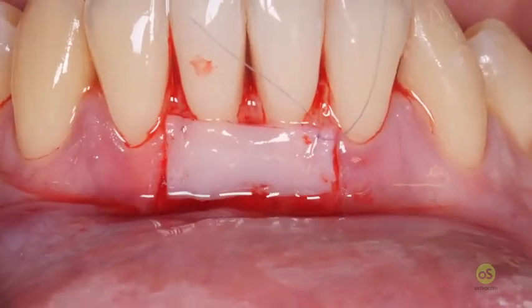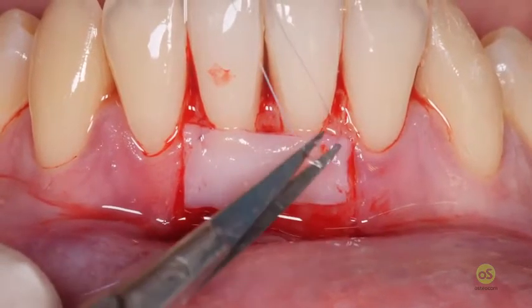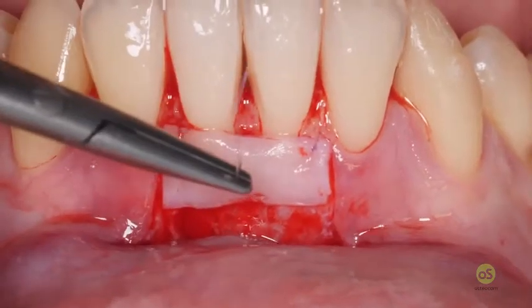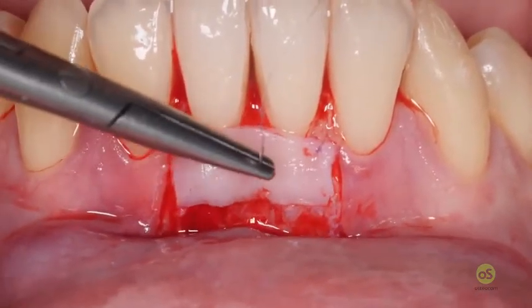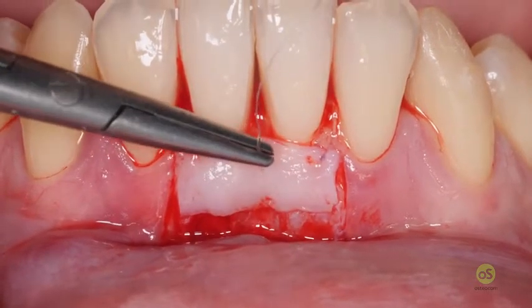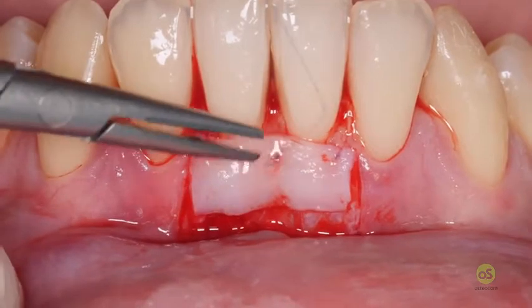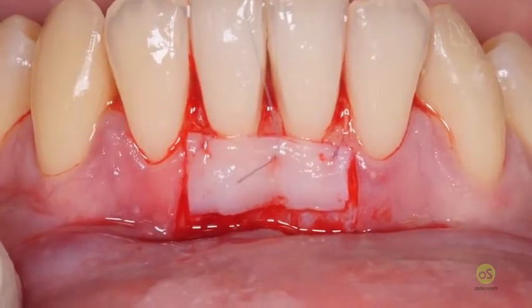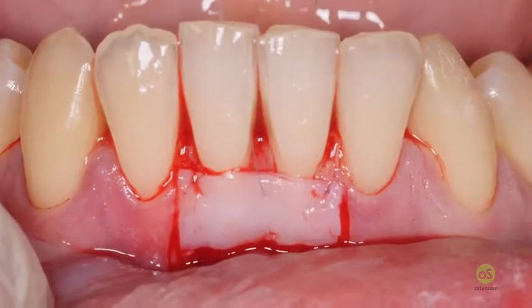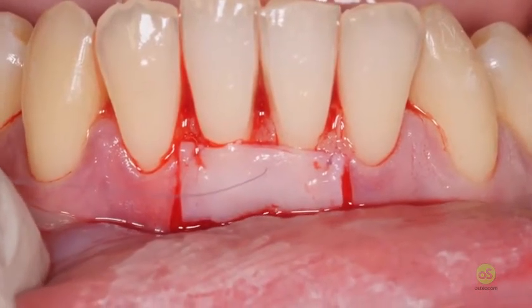Now the last one, because this papilla has to be sutured in a different way, because it's like the papilla around the implants. I don't know if you remember, full thickness from the graft to the lingual aspect, getting lingually with a needle. Take the needle lingually. You have some problem taking it from the buccal to the lingual, but this is a full thickness perforation of the papilla.